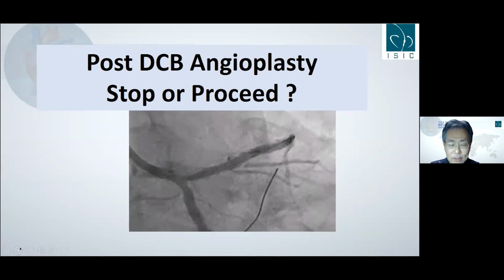So OCT imaging should be done to assess the necessity of an additional procedure for the left main and proximal LAD. Angiographically, LCx is satisfactory for the opening, so DCB will work very effectively. However, I wonder about the efficacy of the DCB in the distal left main and the proximal LAD. So imaging should be done for the next step.